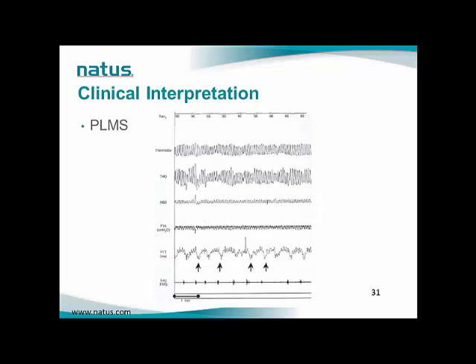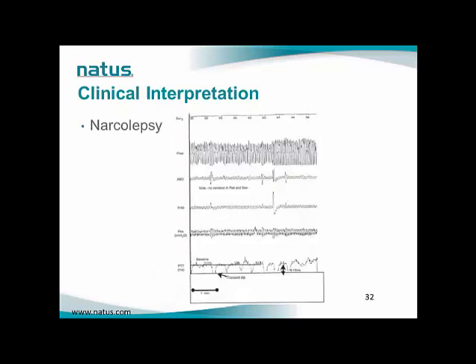In this example, flow shows a normal sinusoidal breathing pattern with no fluctuations in the esophageal pressure. That is a strong evidence of no upper airway resistance syndrome. However, the PTT trace shows a dip in the signal for more than 8 to 15 milliseconds, which is a typical representation of the autonomic microarousals, which are correlated with the repetitive stereotypic movements seen on the leg EMG trace.